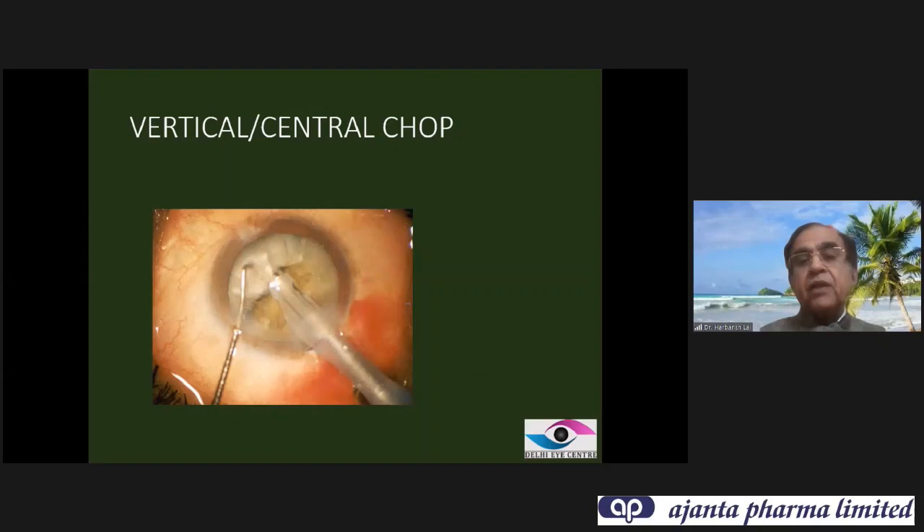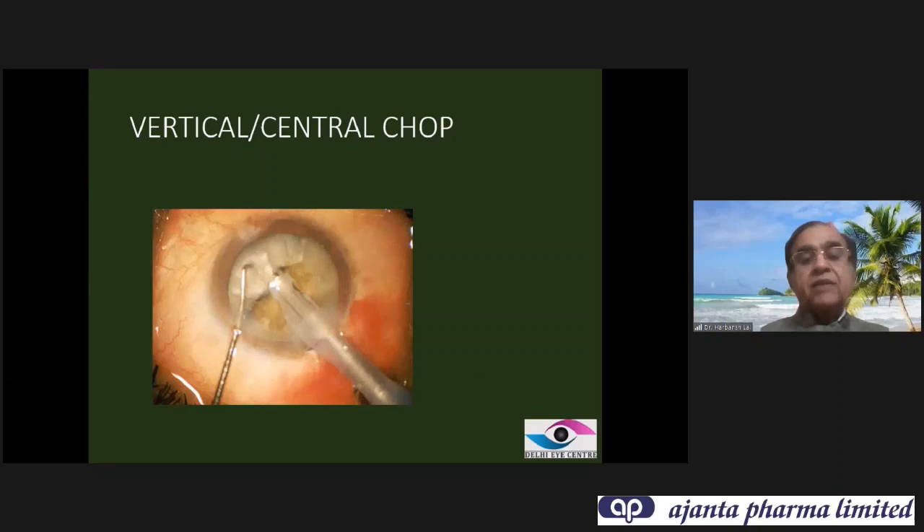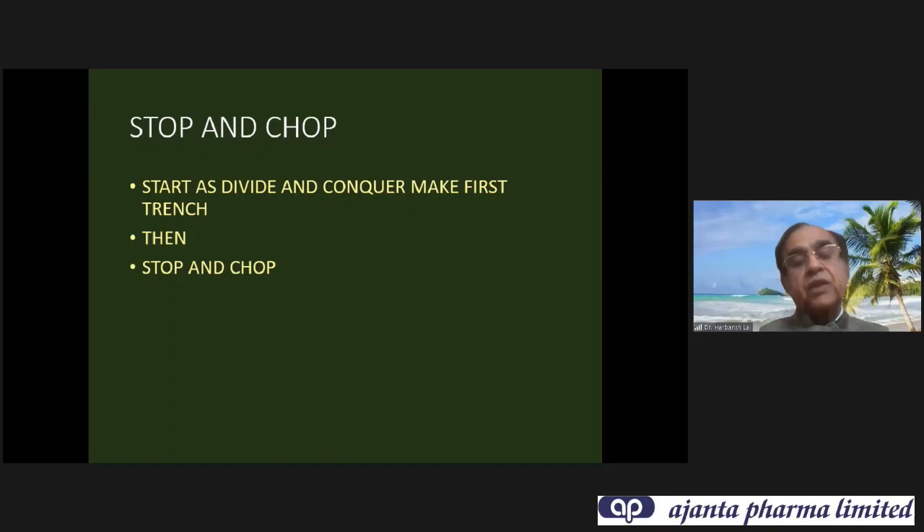Then came the vertical or central chop — we place the chopper within the capsulorhexis margin without going inside. Instead of pulling towards the tip, we bury the chopper vertically downward and separate. Then came stop and chop: you start as divide and conquer, make the first trench, then stop the divide and conquer procedure and go to chop mode.